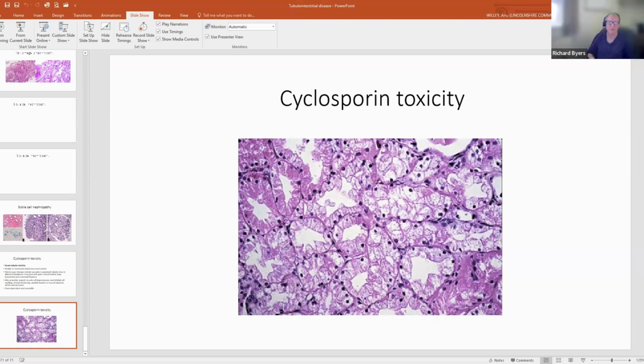And the reason I talked about it today in detail is because there was a case recently, around 6 months ago. The patient had EGPA, Churg-Strauss, and there were no glomeruli in the biopsy. And it looked like it was full of IgG4 positive cells. And I almost ended up saying, oh, could it be IgG4-related disease? Then when I talked to the clinician, I came to know the patient actually has a vasculitic disease, and we just don't have glomeruli in the biopsy. So talking to the clinician and getting the right information saved a lot of hassle. Okay. Well, there aren't any questions from the audience.